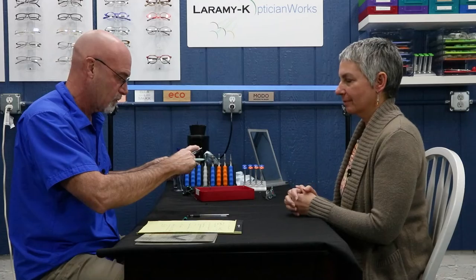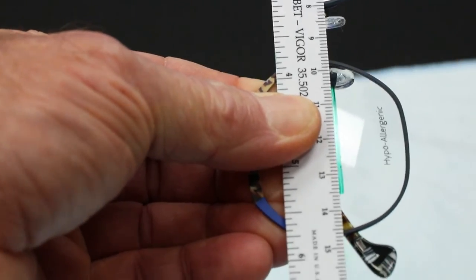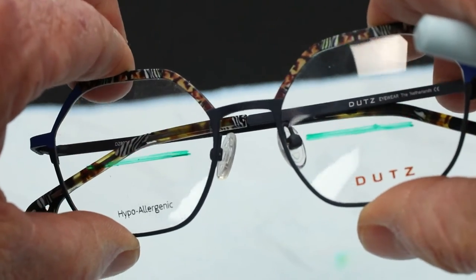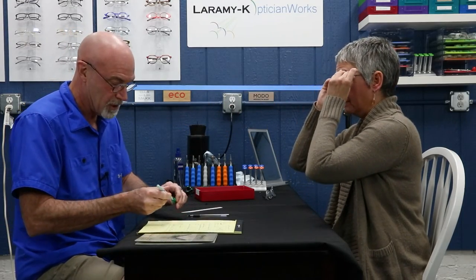Only now am I going to take my PD stick, or any straight edge, and mark that spot with a line. There is the top of the segment. I can put this on, she will see this line — this is the top of the bifocal. Put those back on for me. Regardless of whether she has been wearing them or not, I ask: what do you think? Does that look good? I think so — about the same as it was before. That's a perfect textbook fit.